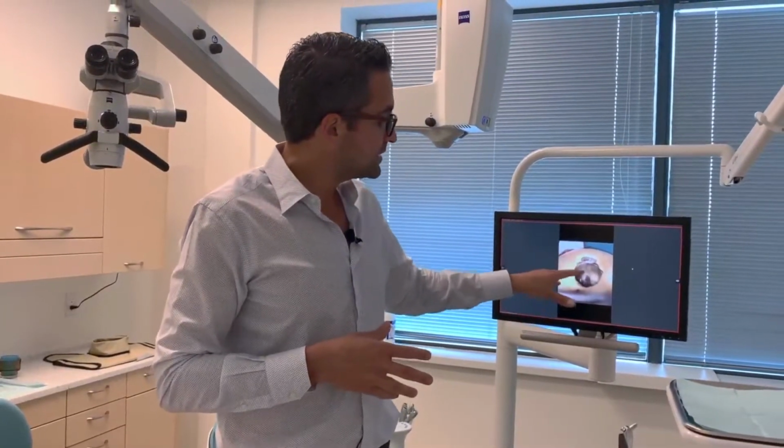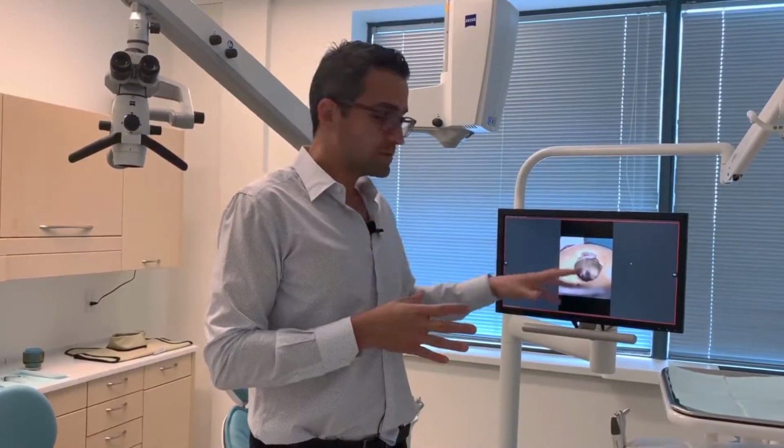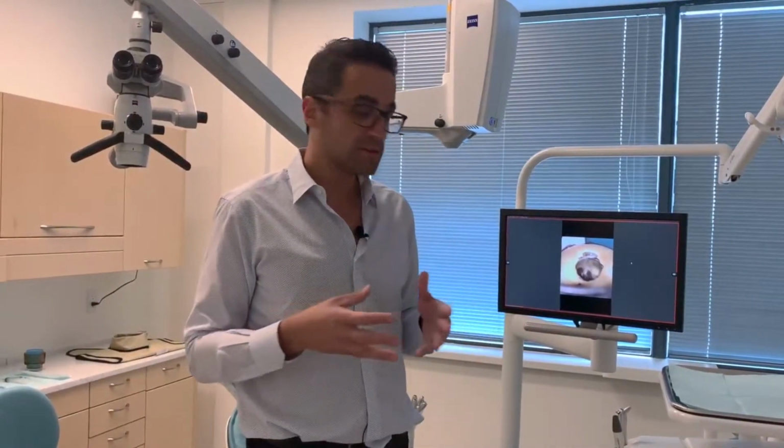Unfortunately, when we see these kinds of observations inside the tooth, it becomes very hard and sometimes even impossible to save the tooth, which is why in this case, I stopped the treatment, I temporized the tooth, and I showed this picture to the patient, and it was self-explanatory. The patient looked and said, "Oh my God, my tooth is cracked." And I told him, "You're right, sir. This is the picture from inside your tooth. Your tooth is cracked, and thus we need to refer you for it to be extracted."